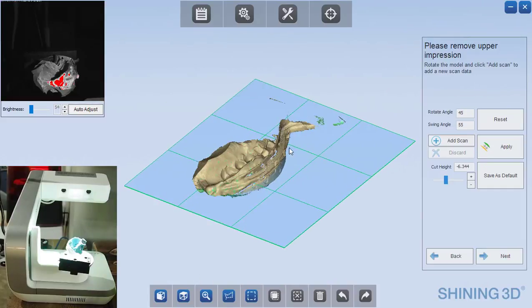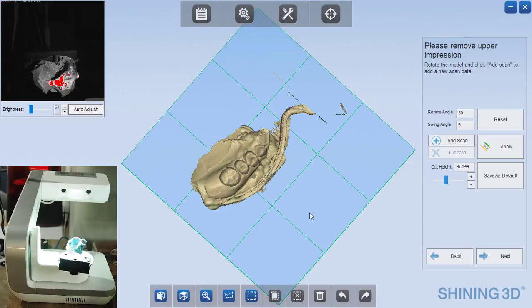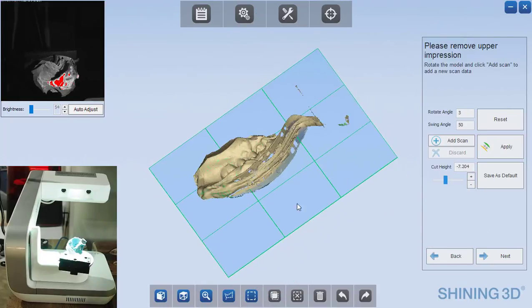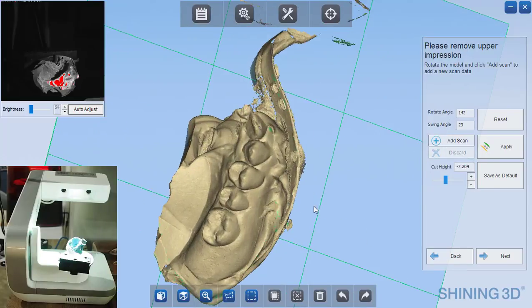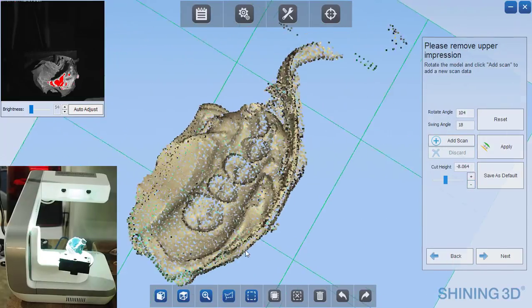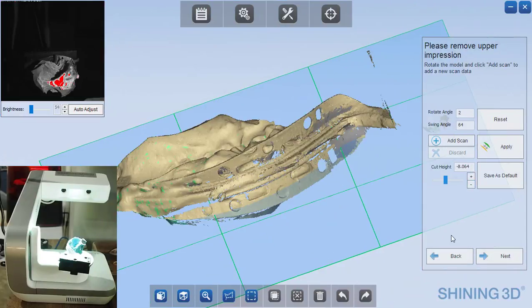Now that completes the scanning on the opposing so we can add to or remove from the cut height. I'm going to cut off any edges and so that looks great. Next.